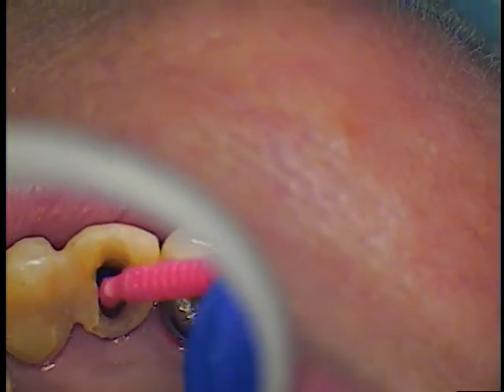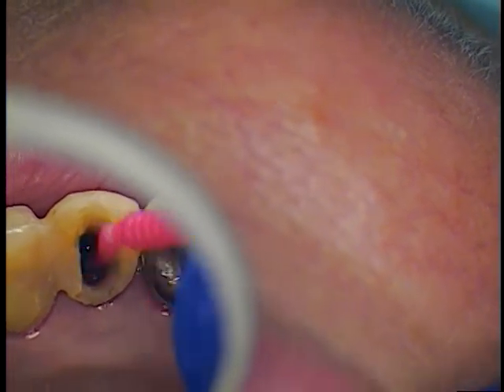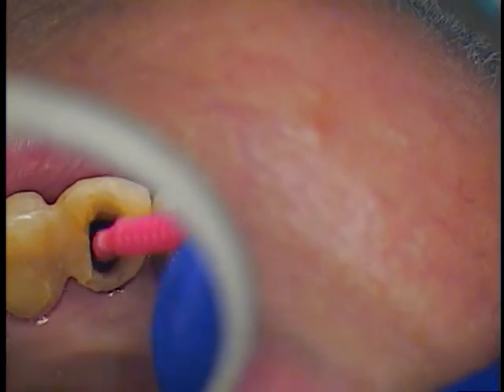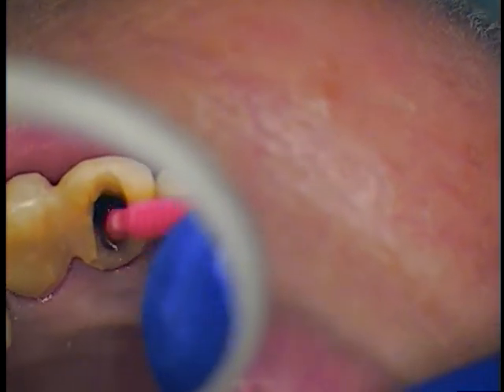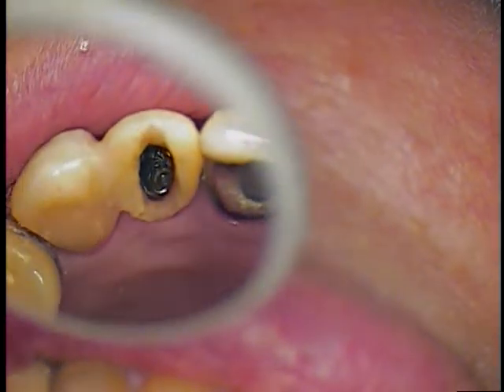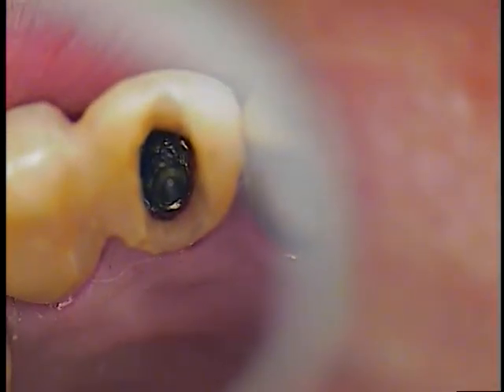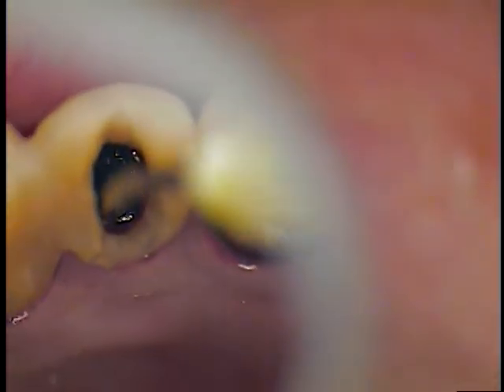We're just going to try to facilitate possibly another screw if possible, but without just hand tightening. We'll put another basal screw in there. Here we go, rinsing again. Okay, microsuction now. We'll look way down inside. Oh boy. Oh, this is abutment.